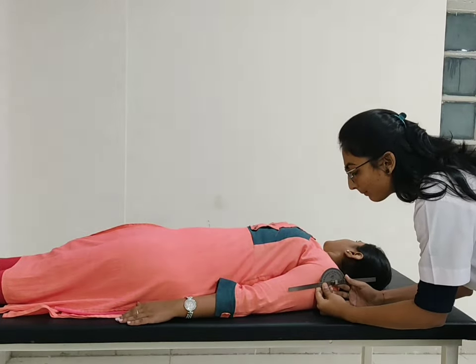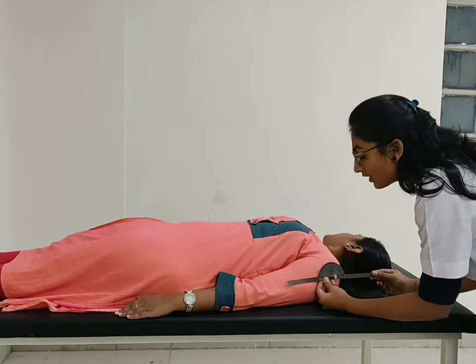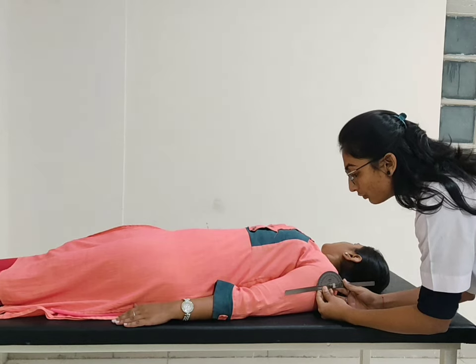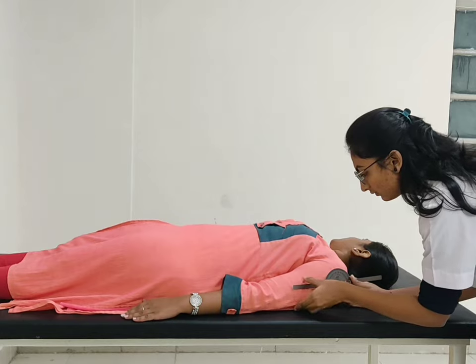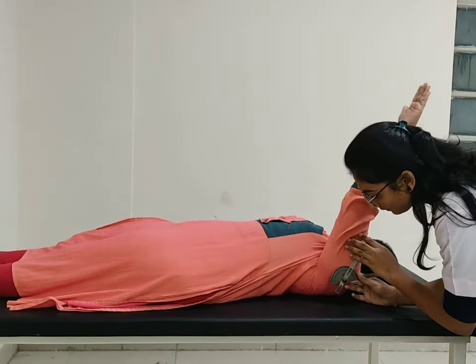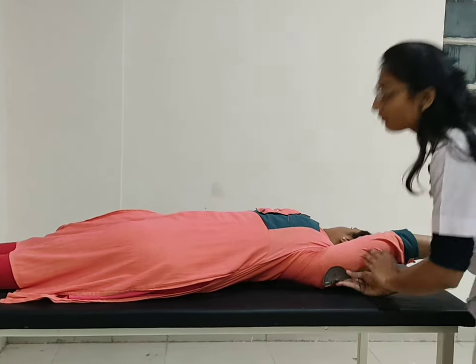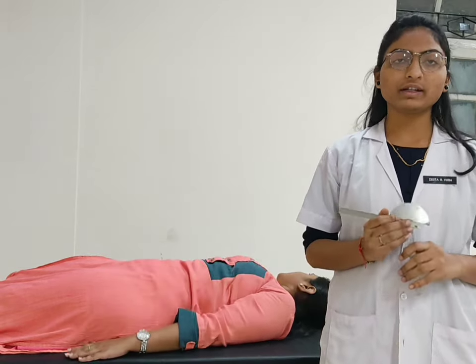Stable, movable arm parallel to the lateral aspect of the arm. And stable arm is straight with movable arm. Now ask the patient to move your hand forward and upward towards the ear. Normal range of motion for the shoulder flexion is 180 degrees.